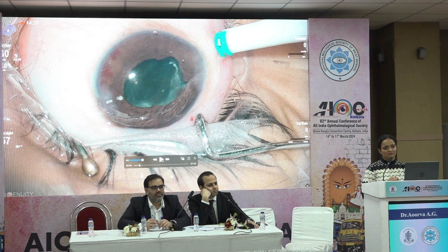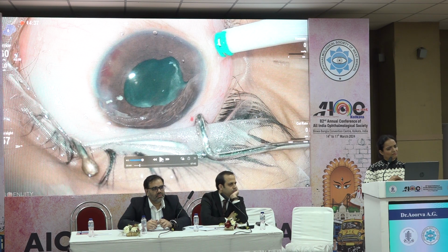Just a thought: instead of our regular trocar cannula, could we have used the AC maintainer so that we could have avoided that injury? Absolutely, it's a retrospective thought anyway. You have done it nicely. Once you decompartmentalize the whole eye, you can just go for AC maintenance and indent, like he said, and see before you put the trocar at the right place where you want to enter.